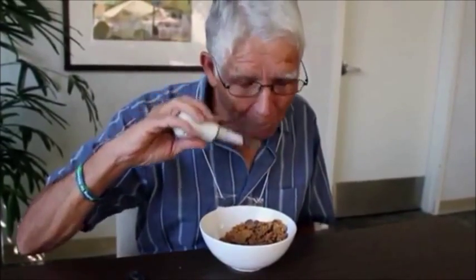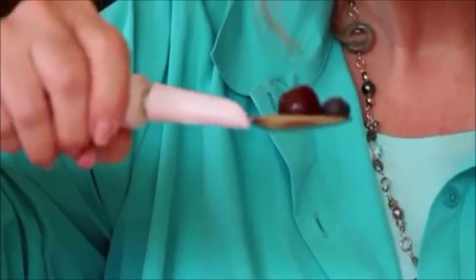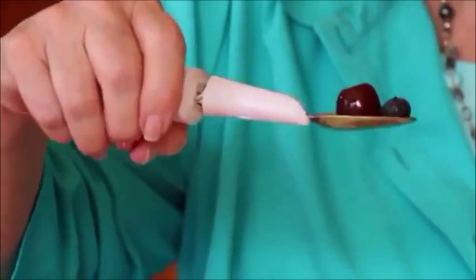Which essentially means, whenever your hand is shaking, the spoon counteracts it. What makes the spoon so unique is its ability to distinguish between hand tremor and other hand movements, such as your hand going from the bowl to your mouth, which allows it to respond only to the hand tremor while keeping the user's initial motion intact.